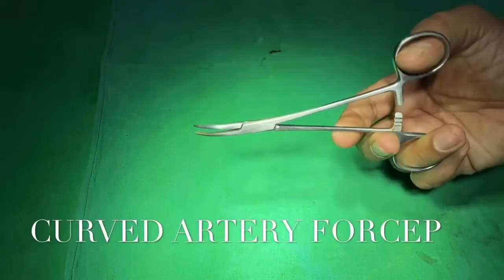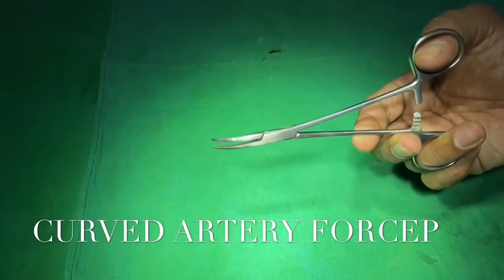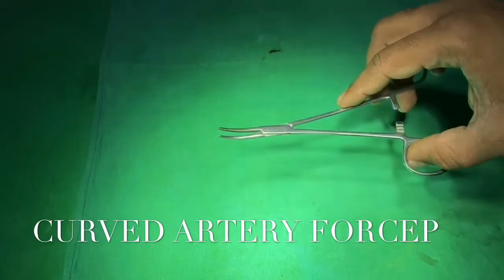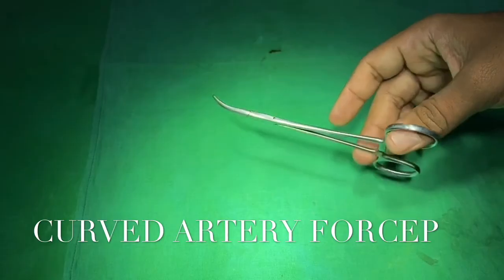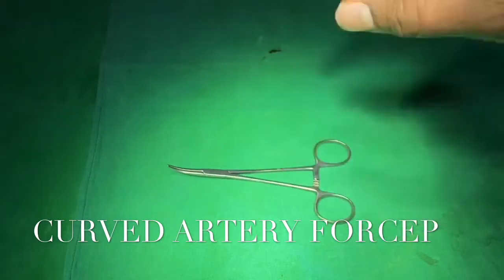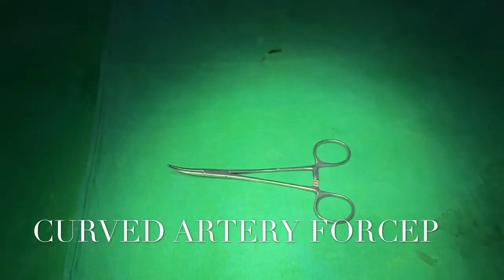This instrument is called curved artery forceps. As the name suggests, the jaws are curved, hence the name. These are used to hold bleeders — whether artery, vein, or venules — for hemostasis. Sometimes it is also used to hold structures like peritoneum, fascia, and aponeurosis.